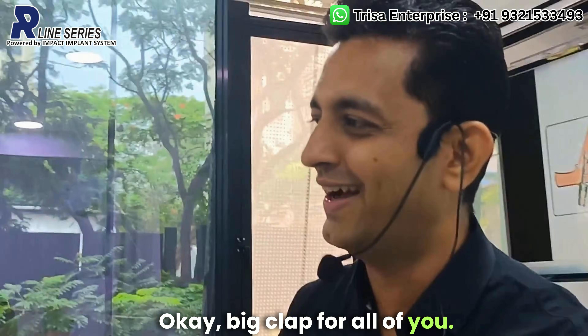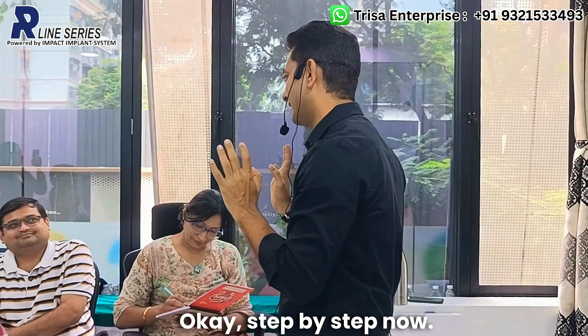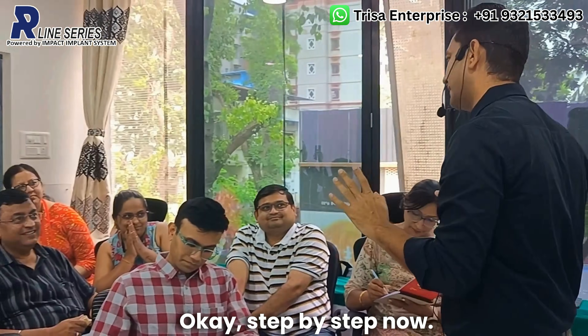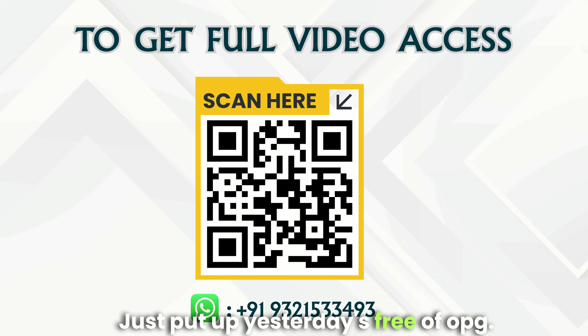Great work by everyone. Now that we have understood the step-by-step procedure, one activity for all of you — please put up yesterday's free OPG.